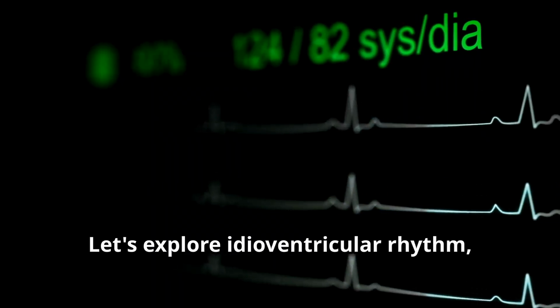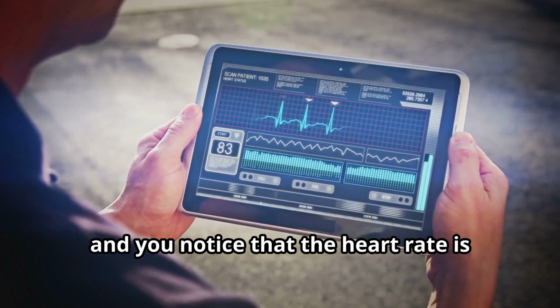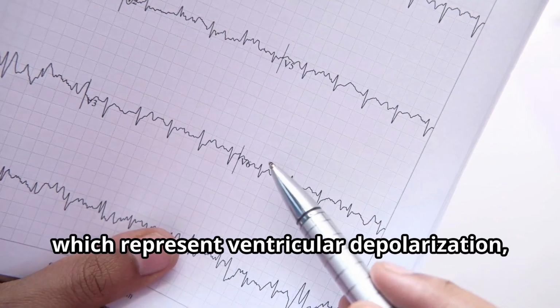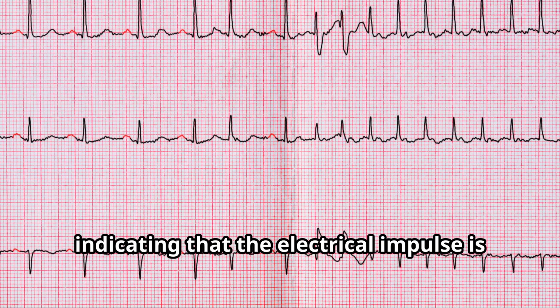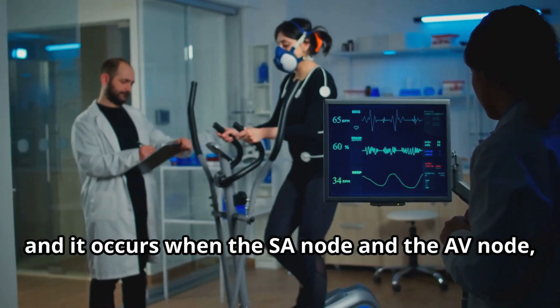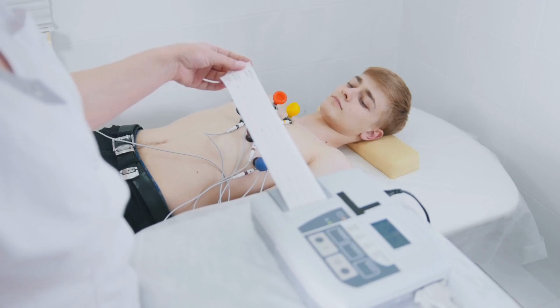Let's explore idioventricular rhythm, a heart rhythm that originates in the ventricles, the heart's lower chambers. Imagine this, you're looking at an ECG, and you notice that the heart rate is quite slow, typically between 20 and 40 beats per minute. The QRS complexes, which represent ventricular depolarization, are wide and bizarre-looking, indicating that the electrical impulse is not following the heart's normal conduction pathway. This is idioventricular rhythm, and it occurs when the SA node and the AV node, the heart's usual pacemakers, fail to initiate a heartbeat. The ventricles then take over as the pacemaker, but at a much slower rate.